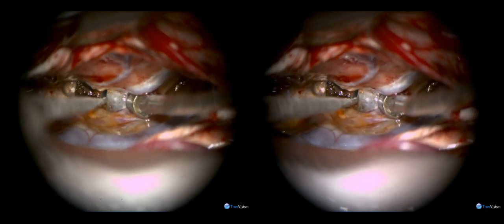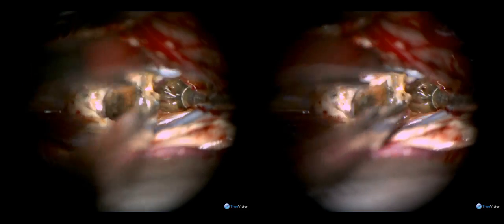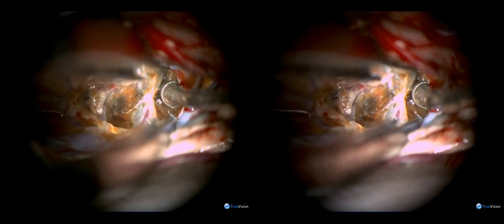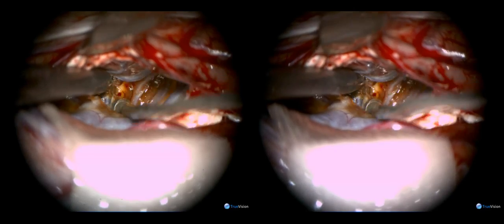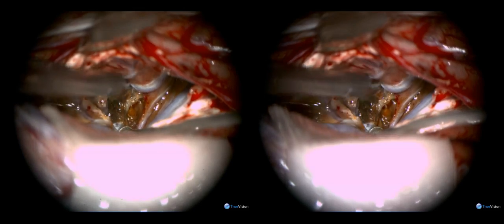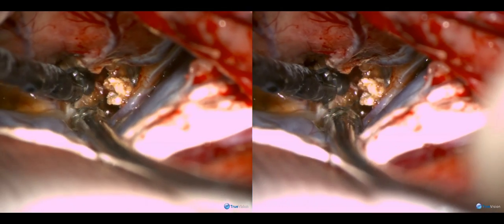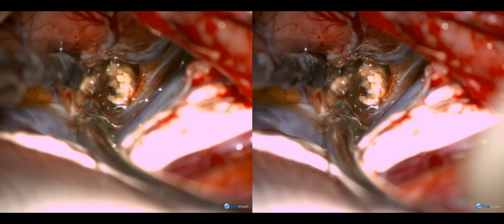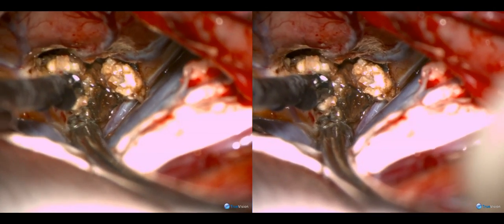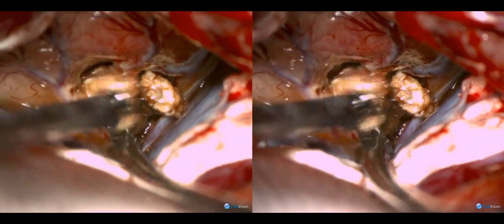The plane between the malformation and the adjacent brain is developed and the pockets within the cavernous malformation are opened and evacuated. This allows the malformation to be decompressed and removed piecemeal. Here is a piece of the cavernous malformation being removed to help debulk the lesion.